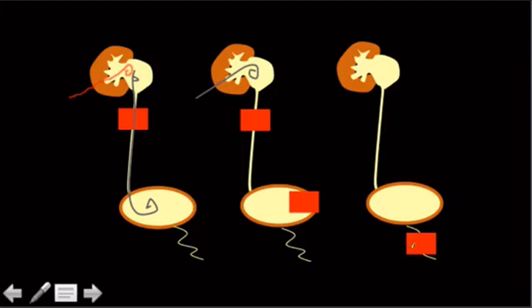All right, last situation is a guy with an outflow problem. He's got BPH, maybe a neurogenic bladder, big prostate cancer, or a urethral injury here. This is a guy who would be a good candidate for a cystostomy tube. This works fine, this works fine, this works fine, he just can't get out of the bladder, so we'll drain out that way. All right, there you go.